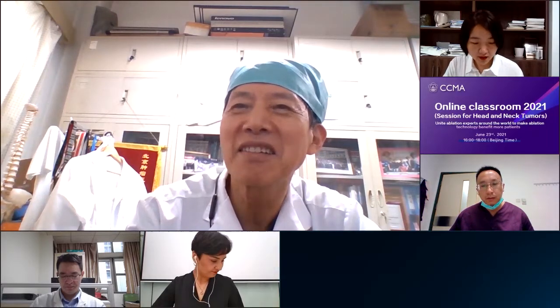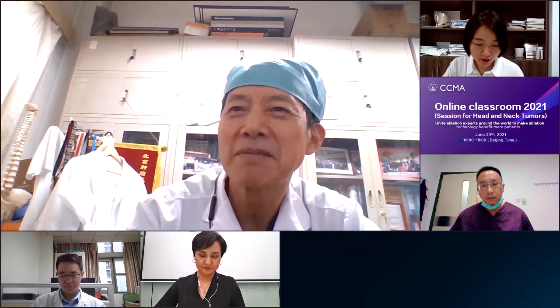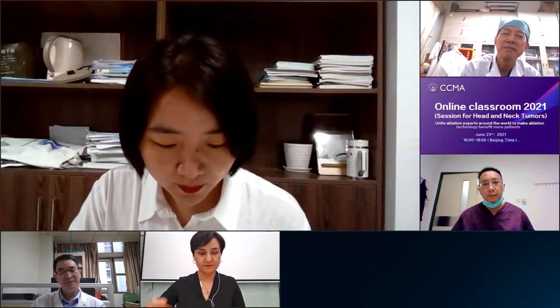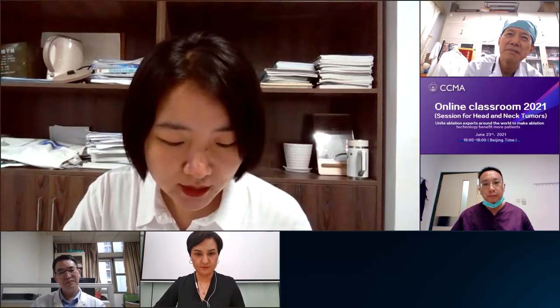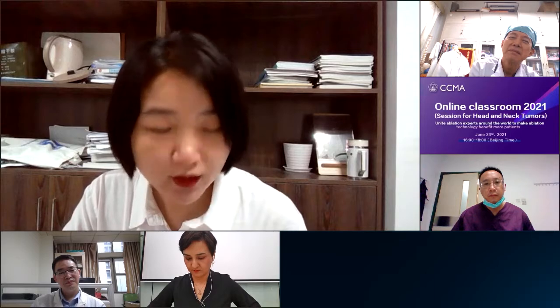For cystic thyroid nodules, I think Professor Long's idea is very good, but in our department we haven't used the hardening agent. For cystic nodules, the most important step is to extract the liquid, as Professor Long has said.